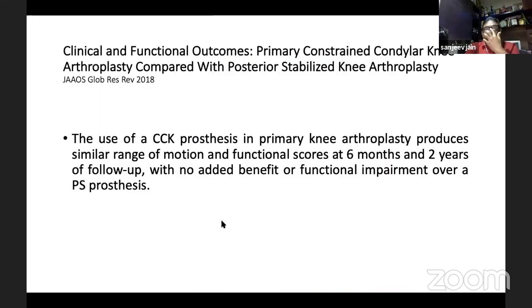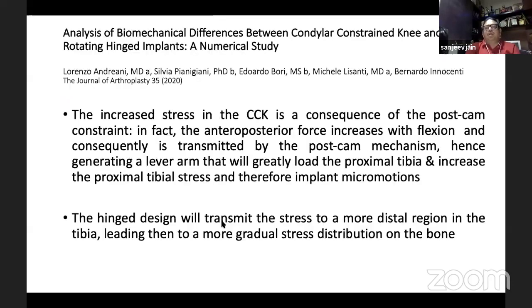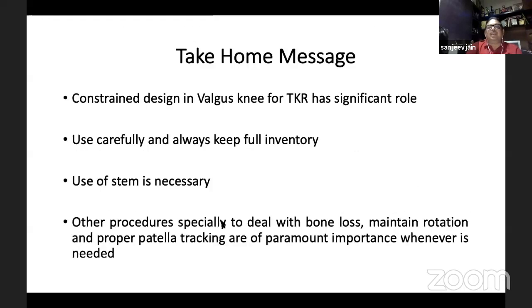There are papers which look at the clinical outcomes between these two prostheses, comparing CCK and primary PS up to a couple of years. There is no difference; we have to see the long-term data. There are also papers talking about the difference between the condylar constrained design and the rotating hinge, and they all show that wherever you use a higher constraint variety, you need to stem it, because there are forces which will be transmitted to the bone-implant interface, and the stem will prevent loosening.